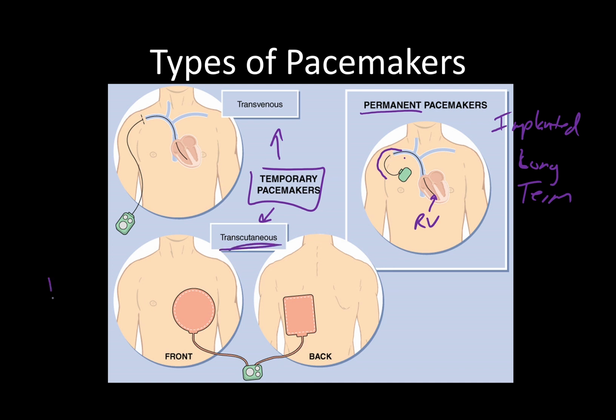And this is essentially the pads. So all of these lectures prior, when I talk about the bradycardic patients and you put on the pads, that's what I'm talking about. There's actually 2 flat stickers that you put on the front and back of your patient, or however the picture on the sticker says to place it. And that's what conducts electricity.